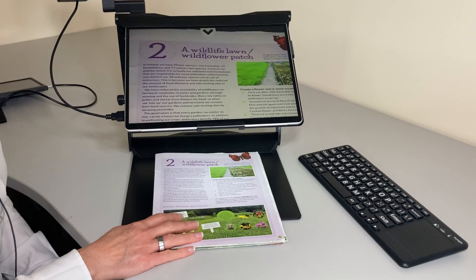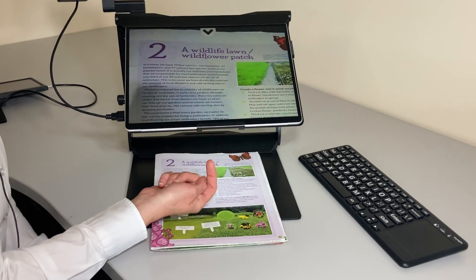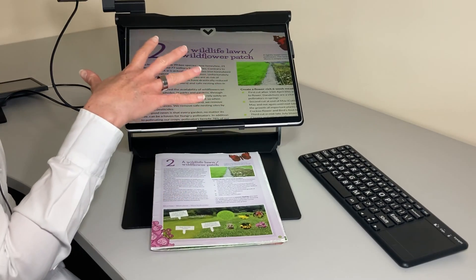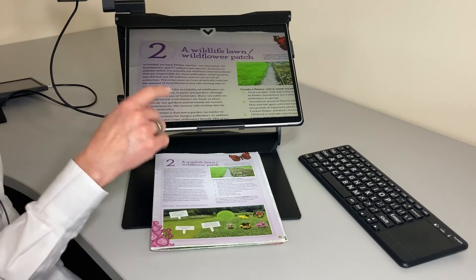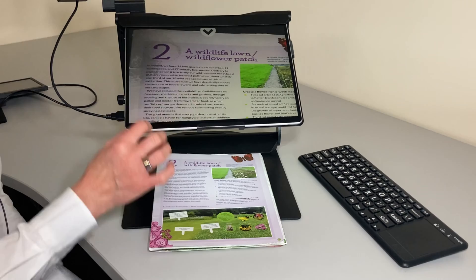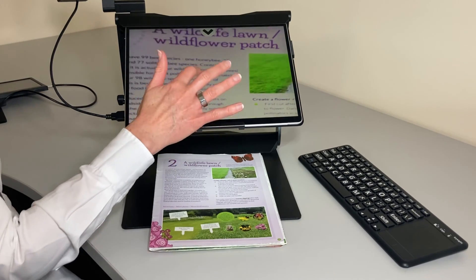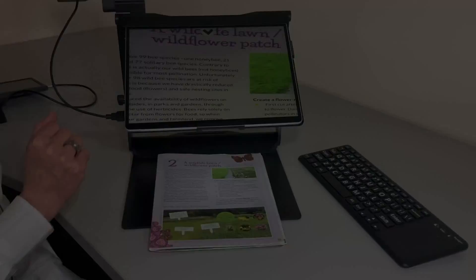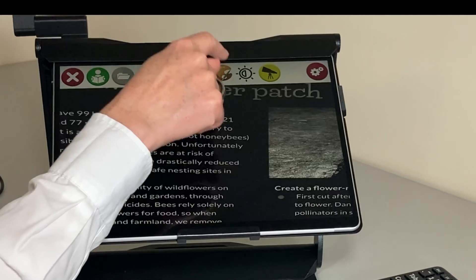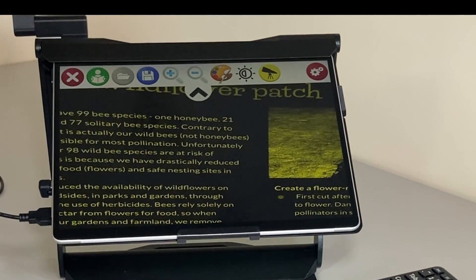Now we're going to look at the near magnification feature, which uses the camera on the Surface. The Surface tablet itself is in the stand upside down, which gives us the use of this very high quality camera. We can put our book underneath, zoom in, and if it goes a bit blurry we can just refocus. We have lots of options in the toolbar where we can change the color schemes, which can make a huge difference to a student with low vision.